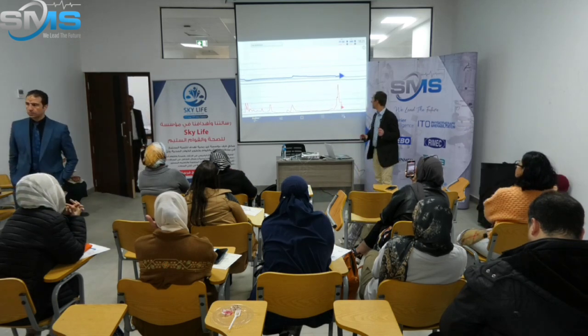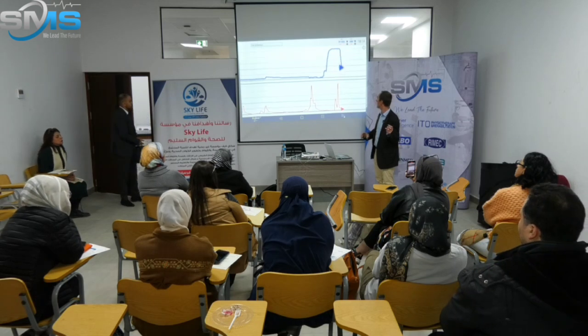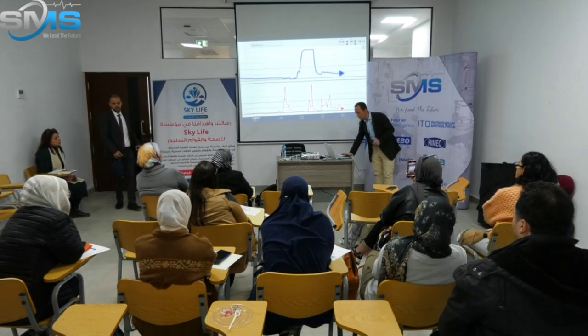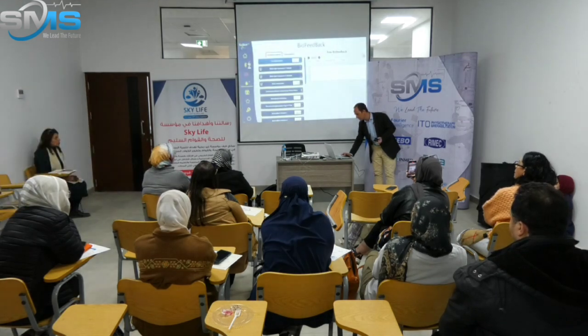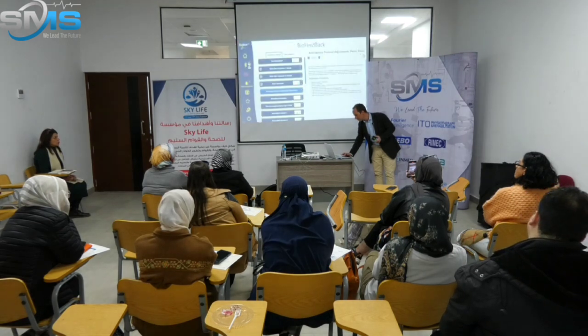Okay, so here we can do it willingly. I contract, I move, I release, until the reflex comes back. Once we think the reflex is back, we can test it on something more difficult.